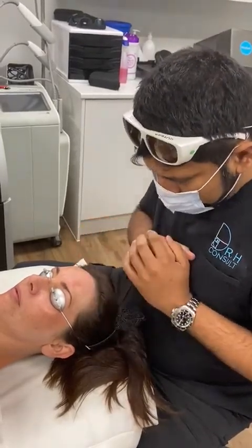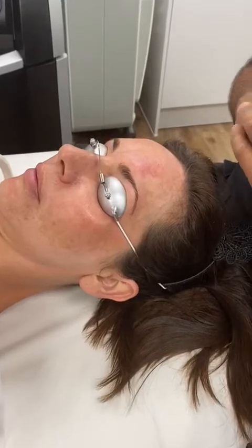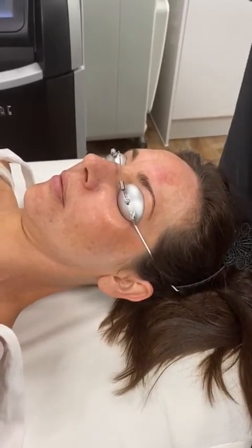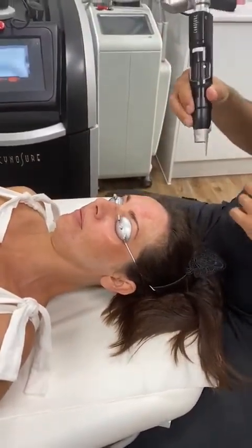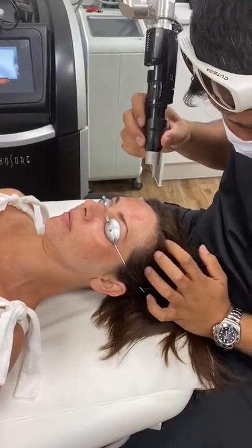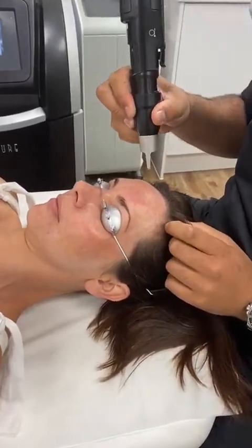I'm happy with this initial reaction. There's a little bit of light frosting and now there's a little bit of erythema that has developed. What we're going to do is continue with the 755 while doing a little bit of gentle cooling in the background. I'll show you the way we're doing this — the laser's just warming up — and when we're ready to go, you'll be able to see how we're doing that.